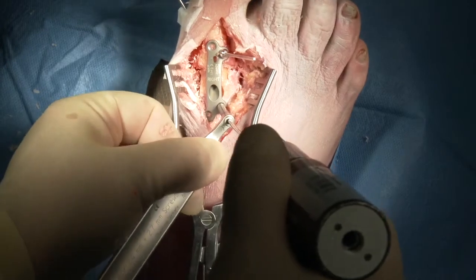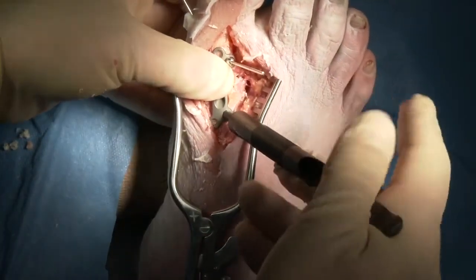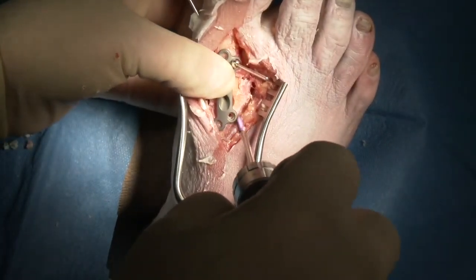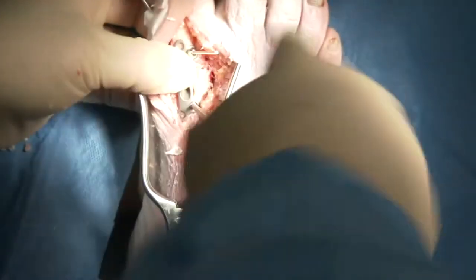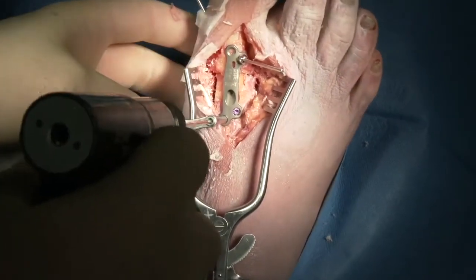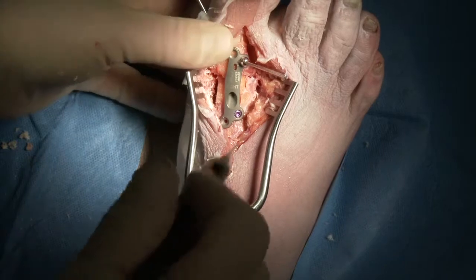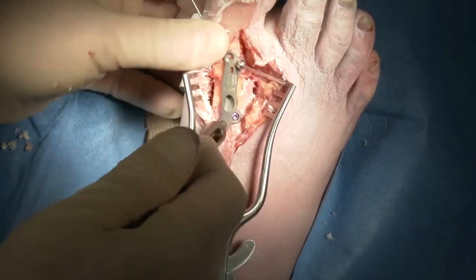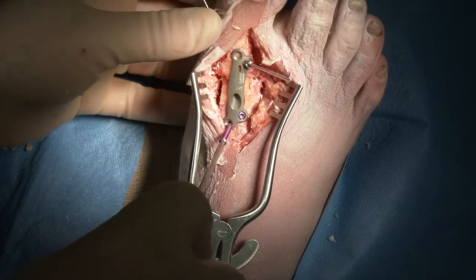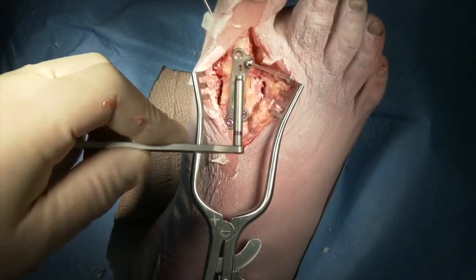Once the plate is in place, we'll go ahead and attach our screws into the first metatarsal. We can use the variable axis drill guide to make sure that we get the screw directed to get maximal purchase on the metatarsal. We check our depth and place our proximal screw, then place our second proximal screw in a similar fashion, again trying to maximize the purchase on the metatarsal. You have the option here of using either locking or non-locking screws as determined by the need for the surgeon.